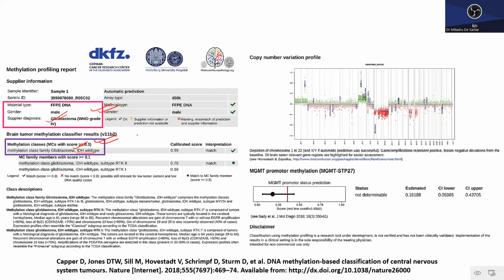Now, this is a very, very powerful tool, and most of the power of this particular test lies in the fact that it can assay for copy number variations. If you see the copy number variation profile on the right, the green and red shades toward the middle are basically the stable copy numbers, whereas a few chromosomes seem to have copy numbers which have gone up, that is a positive gain, the ones in green, which would be the amplified ones. And those below the baseline, the ones in red, would be a chromosomal loss. We shall be seeing a few more of those plots.